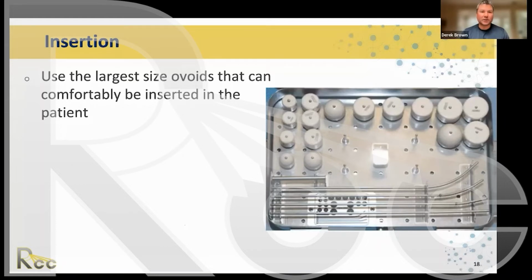Remember, we said at the start, tandem and ovoid brachytherapy, HDR brachytherapy, is necessary to be included along with external beam radiation in order to cure our patients. So we would much rather include that using whatever imaging technology that we have. We're going to create a standard plan to point A, and we'll treat the patient with our point A plan. Does that make sense, Gregory? Yes, yes, thank you. Thank you for the questions.